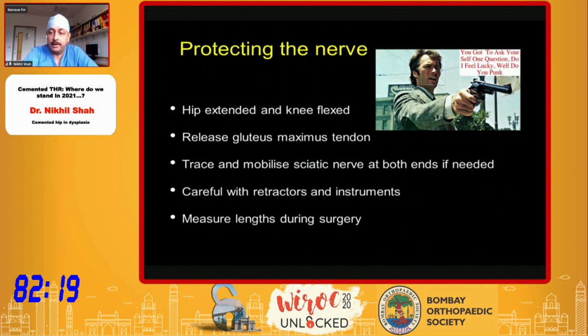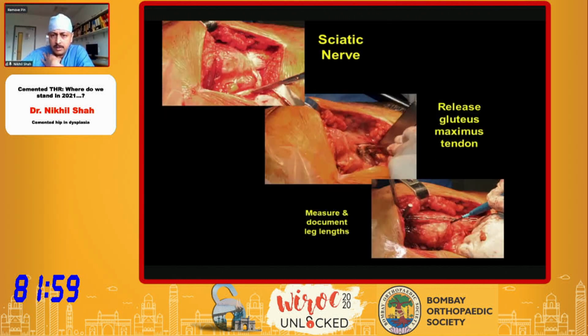The other job that I do is to fix pelvic and acetabular fractures, and therefore I was always taught to be paranoid about the nerves. I keep the hip extended and the knee flexed. I generously release the gluteus maximus tendon if there is any tightness at all. I like to trace and mobilize the sciatic nerve at both ends, and then be very careful with retractors and instruments. And then you have to try and measure the length during surgery so you know how much you're lengthening.